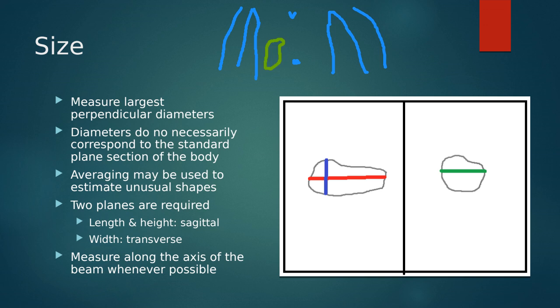But say we find a mass in that kidney that the longest part of it goes like this, right? So say there's a mass like that right at the end, right at the inferior border of that kidney that kind of sits elongated like that. Now, for us, for our transducer, we would typically measure that as a transverse measurement. But because that mass sits the longest in that perpendicular plane, we need to measure that as a sag measurement.